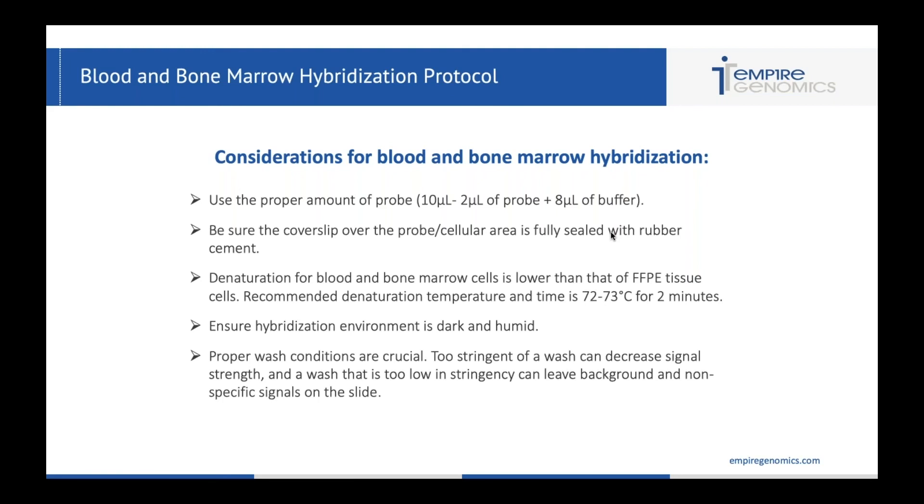Wash conditions are really crucial. I see a lot of labs that feel they have a lot of background or weak signals with blood and bone marrow because of a wash that's far too stringent or one that's far too weak. Pay attention to the stringency of your wash and take that into consideration if you're having issues. If you're having background, maybe try to agitate the slides a little more to really get a good wash and remove that excess probe. Proper stringency can eliminate background and ensure your signals are as bright and crisp as they should be.